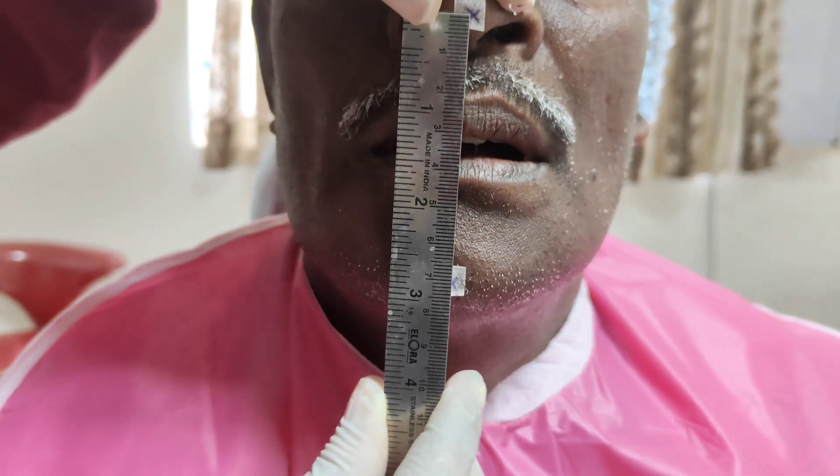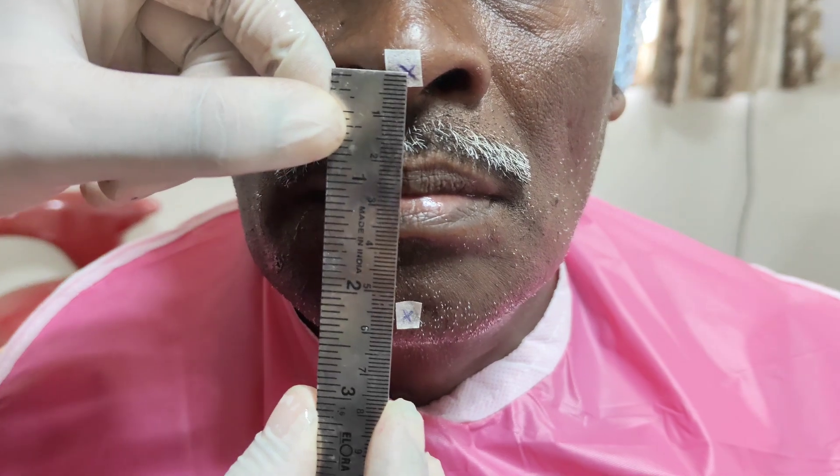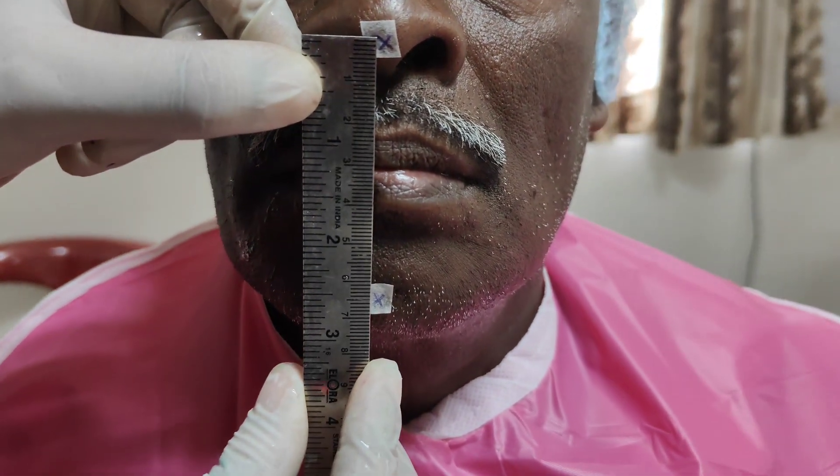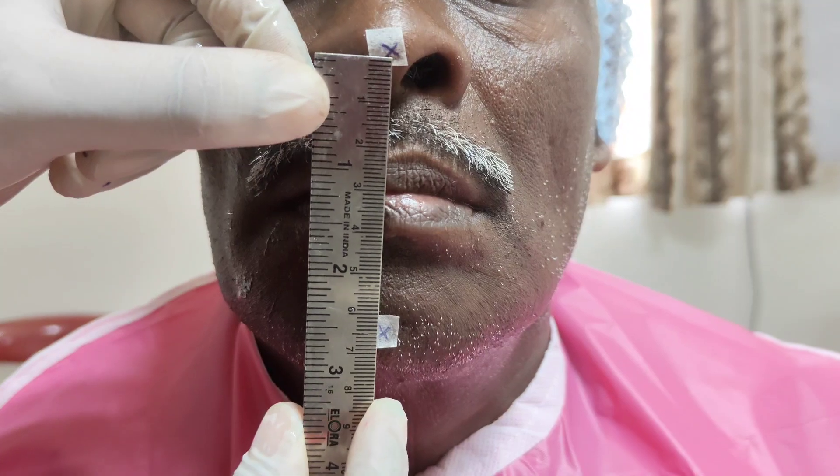After measuring the vertical dimension at rest, the patient is told to bite and the vertical dimension at occlusion is checked. In this patient, the vertical dimension at rest is 66 mm and the vertical dimension at occlusion is about 63 mm, giving approximately 3 mm of freeway space clearance.